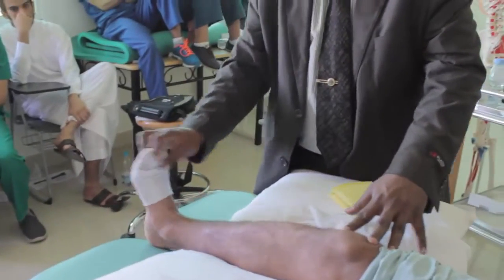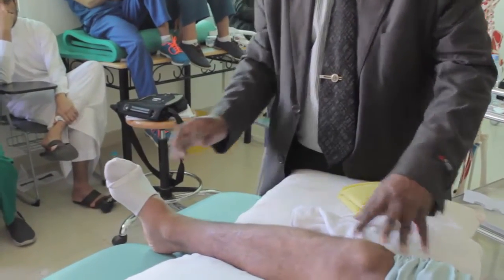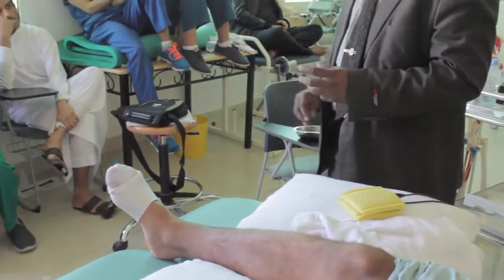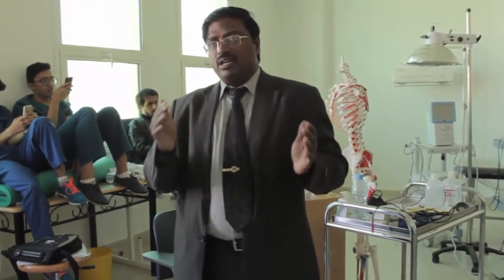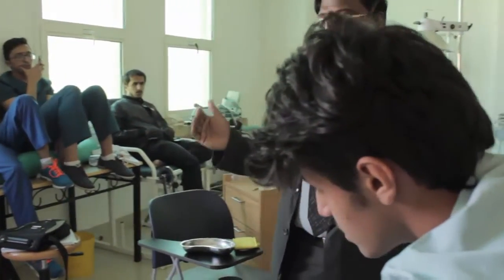When to stop the treatment? Whenever you see fatigue in the muscles, that means initial contraction is full, later on contraction is weak, that means the muscle is getting fatigued. When you see the fatigue in the muscles, you have to stop the treatment, give some time rest, again the next dosage. So this is how you do the duration.